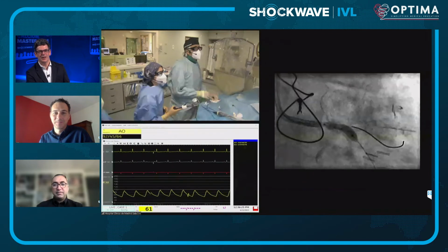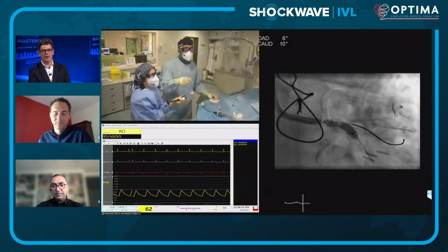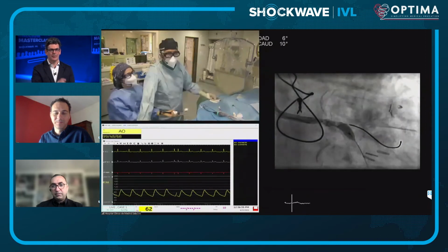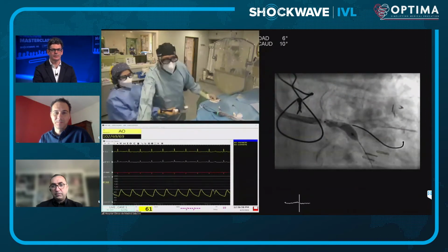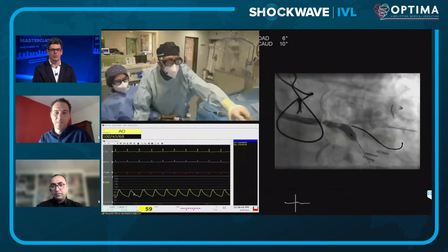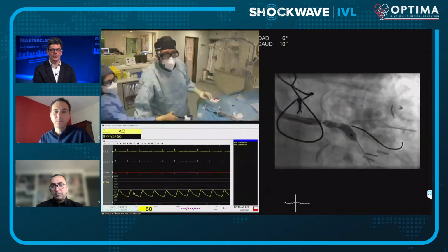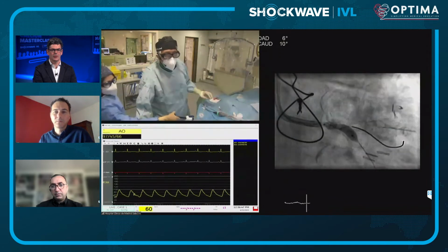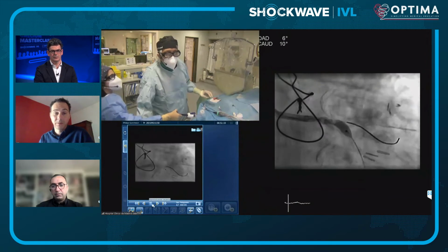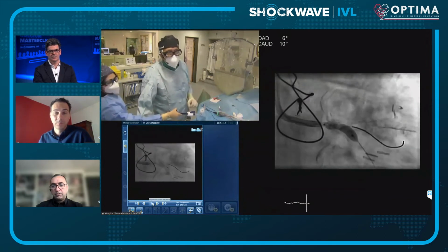No. So I can see that's already expanding more. It's much better. Yeah. Much better, but not fully expanded. No. Let me just show you very quickly. I have some difficulties here in seeing through this, but basically what I'm going to show you in a second is the balloon when we, in the previous, I don't know if you are seeing the images that I'm showing. Show the sync vision. Yeah, let me see.